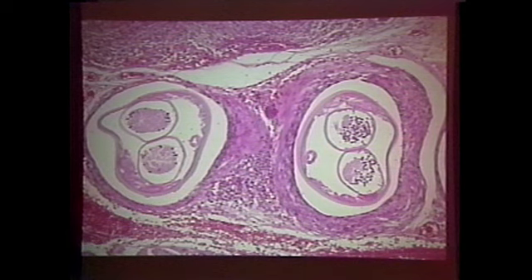Anyway, small intestine. So what group is it? It's a filarial nematode. Well, you think it's a filarial nematode. But let's look at what sex. Female, huh? And what does the female have in its uteri? Microfilariae. That's what it is. I mean, the whole package is complete. It's a filarial nematode. Now, you people who would like to play the vet game, huh? What would you say? Well, you would be a fool not to say Dirofilaria. You know, ectopic Dirofilaria immitis in a dog. I mean, I would buy it for a little while.